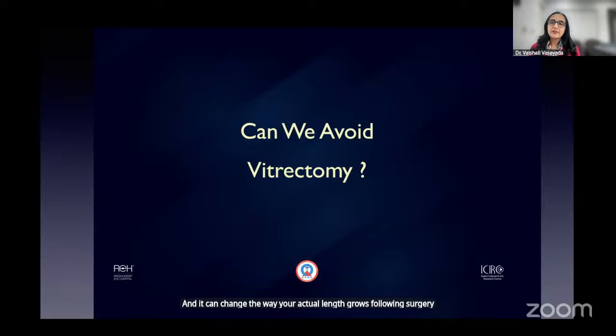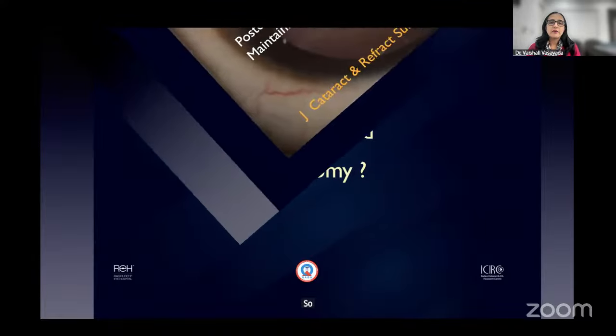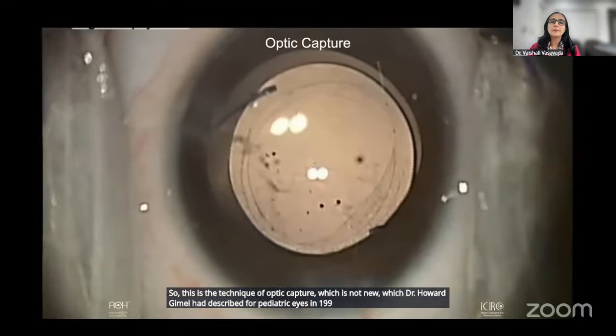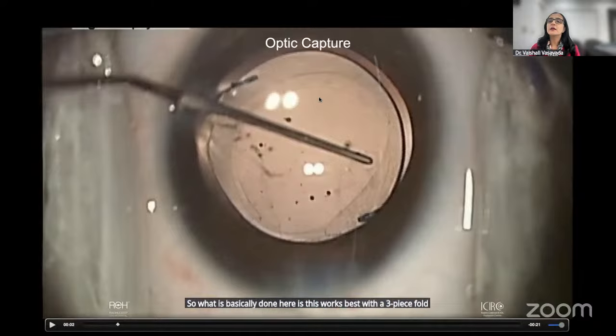So is there a way we can put in an IOL safely and yet not do a vitrectomy and not have a PCO in the future, very early in the future? So this is the technique of optic capture, which is not new, which Dr. Howard Gimbel had described for pediatric eyes in 1994, way back. So what is basically done here is this works best with a 3-piece foldable IOL, any company.